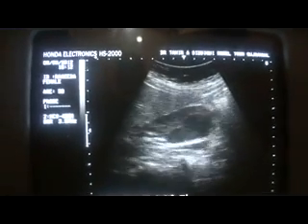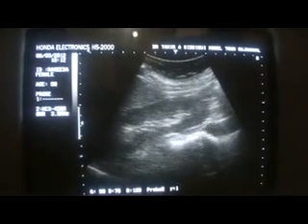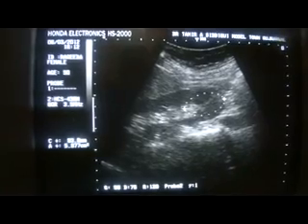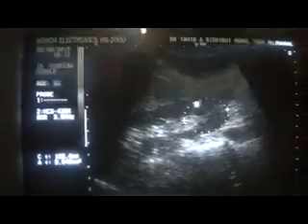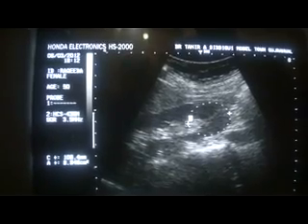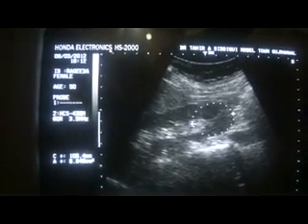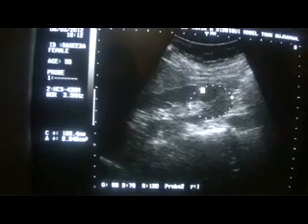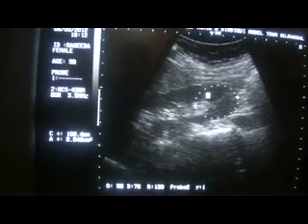Moving further, here we see the lower pole of the kidney, also called the inferior pole. This is the cortex with medulla. This is also a pyramid, and this is the medullary region. Below the capsule is the cortex. The cortex is normal; its echogenicity is less than the liver echogenicity, and the cortex and medulla are normal.